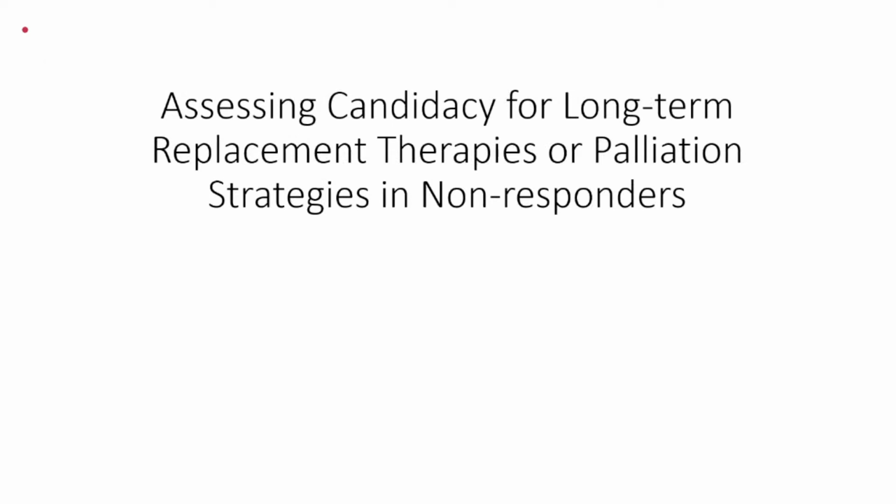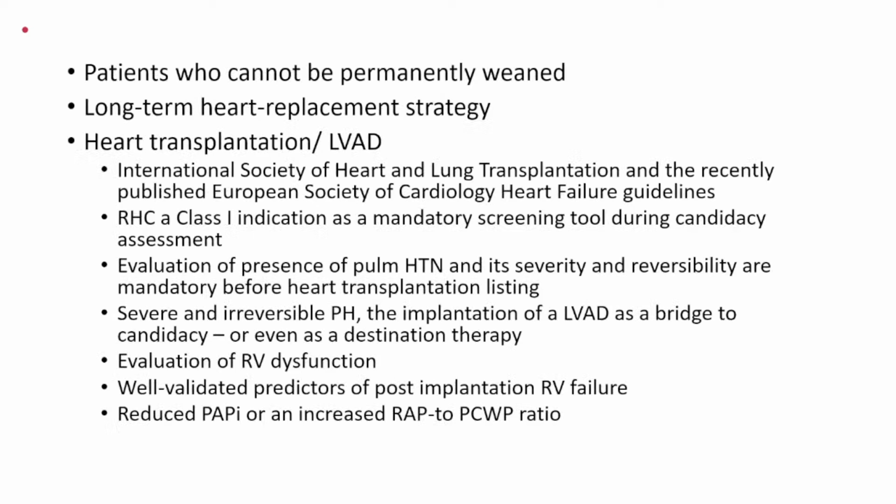Then Swan-Ganz can help us assess the candidacy of whether to transplant or LVAD, because the ISHLT has recommended that right heart catheterization is a class 1 indication as a screening tool for candidacy assessment. And we need to evaluate the presence of pulmonary hypertension, its severity and reversibility before we go for heart transplant. With severe or irreversible pulmonary hypertension, we need to implant an LVAD as a bridge or as a destination.